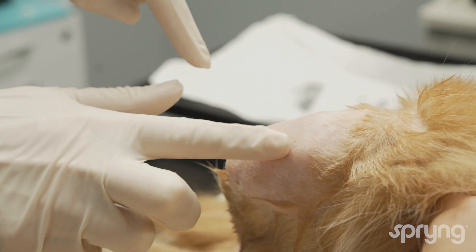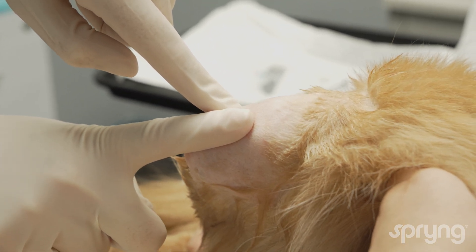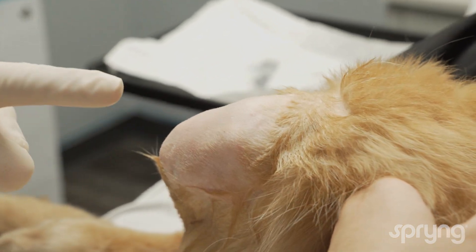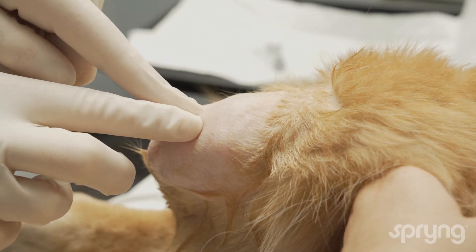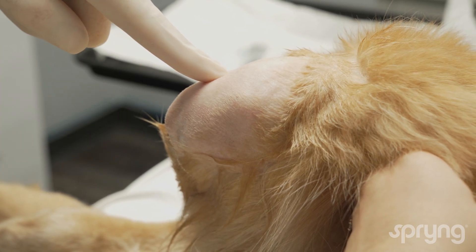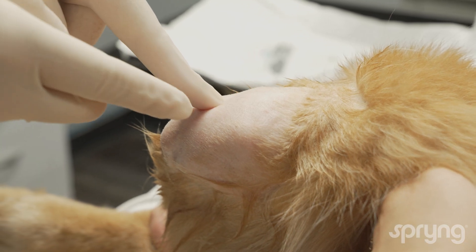Palpate the medial and lateral peripatellar regions and identify the direction of the joint line. Some effusion may be palpated when the stifle is placed in a more flexed position. The assistant can also flex and extend the stifle to better identify the joint line.